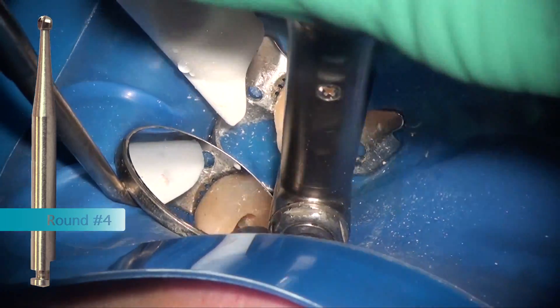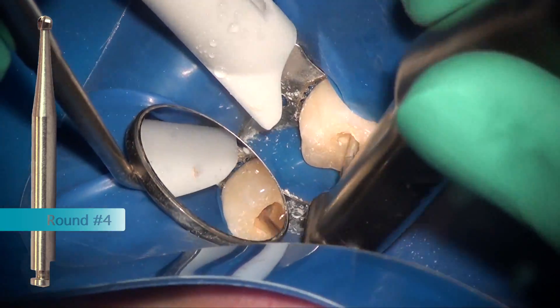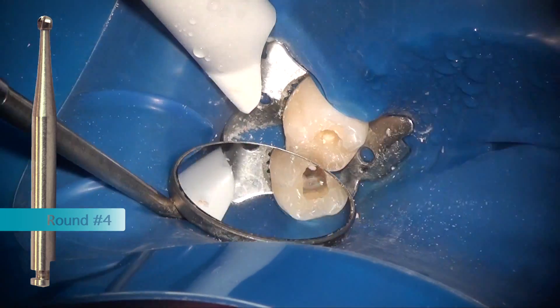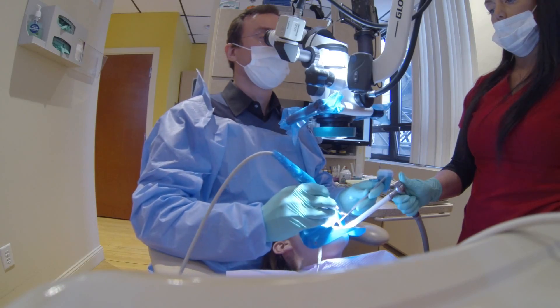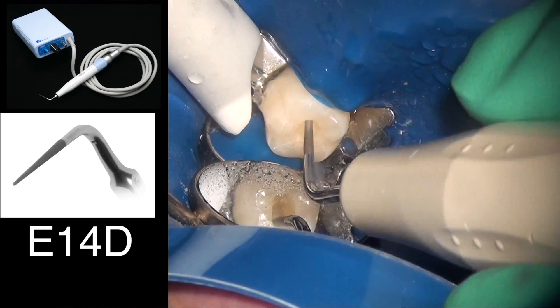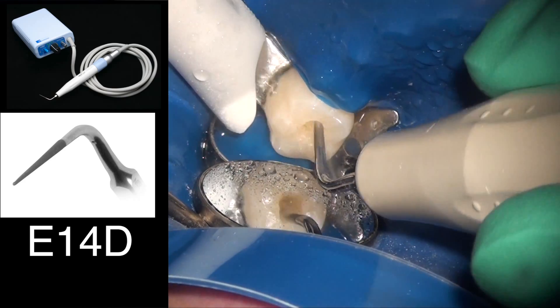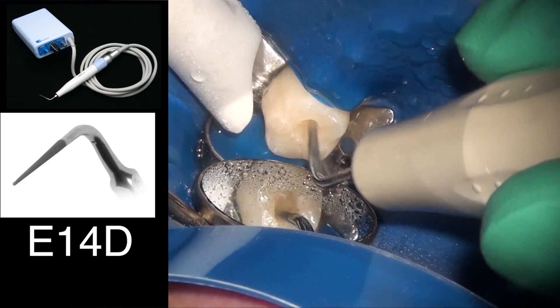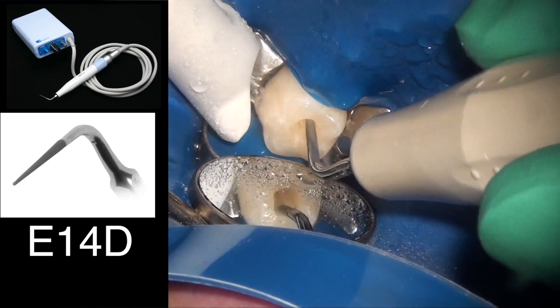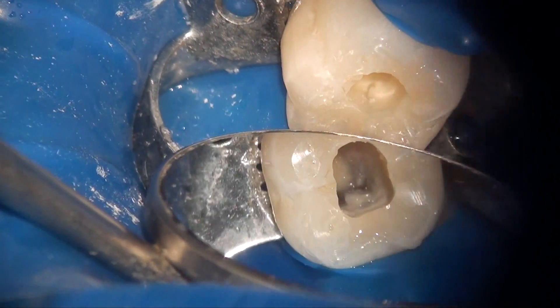It's very important that this step is done. After removing that triangular portion of dentin around the CEJ area, I'm using my E14D ultrasonic tip on the Varios 350 to blend everything in. I'm also using the tip as an explorer, and as you can see everything looks nice and clean and we can see the beginnings of the canals.